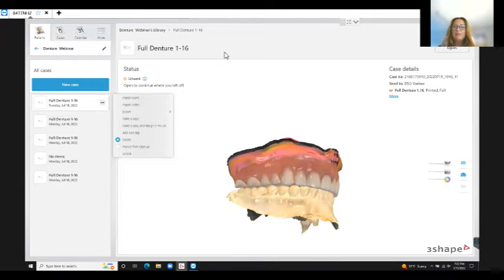And then I'm going to add a little bit too. If I do scan an edentulous person, if they're a gagger, it is a great way to start for a custom tray, right? That way you're not using as much material when the custom tray is in to do this technique. But you have to go slow and methodical on an edentulous.